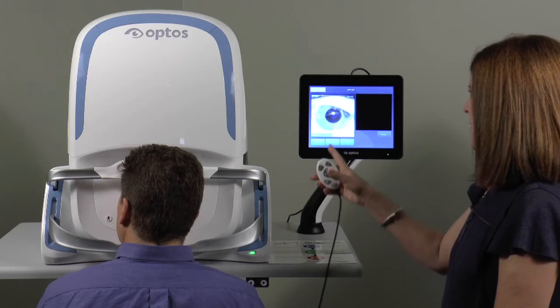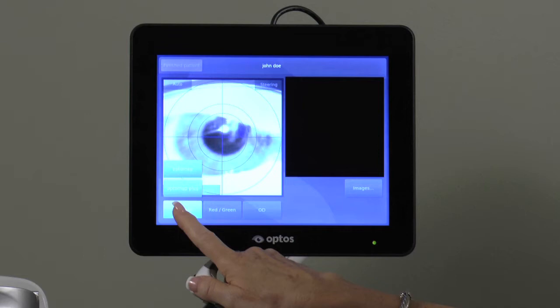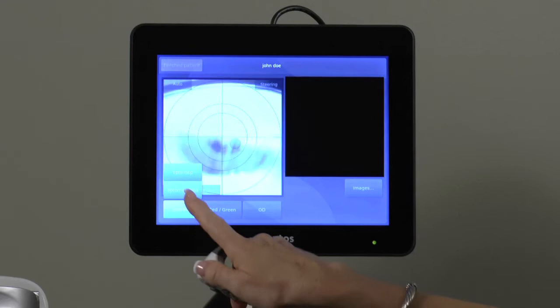Depending on settings and configuration, your device may allow you to choose between either a Screening OptiMap or an OptiMap Plus, which is a higher resolution image used for a medically necessary procedure billed to insurance in certain areas of the world. Now confirm that the appropriate procedure and eye have been selected.